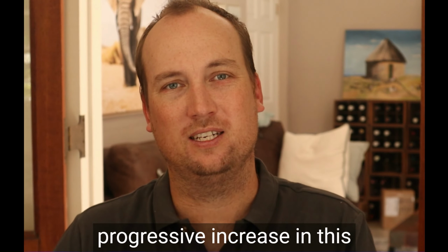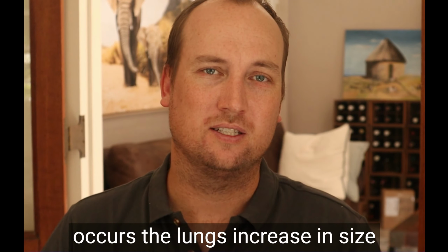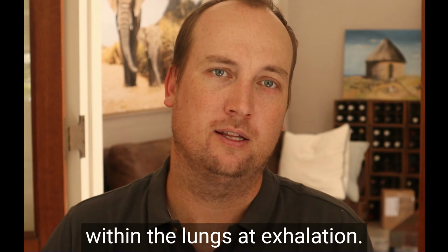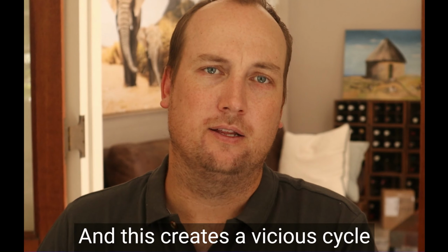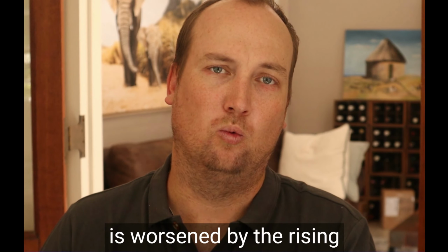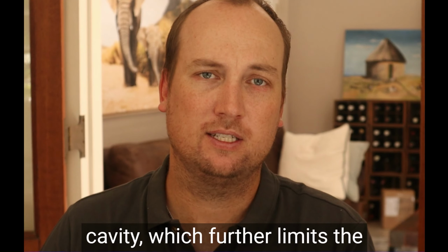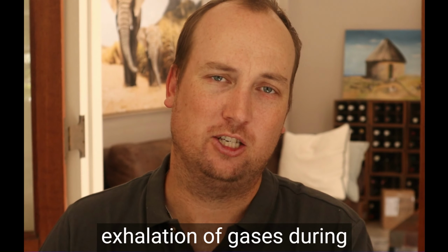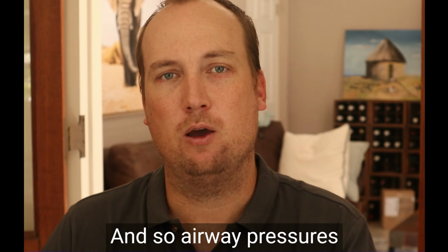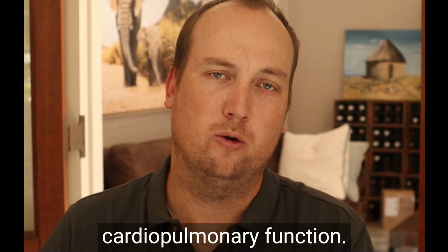And so this results in a progressive increase in this baseline lung volume, and as that occurs, the lungs increase in size, and so they increase in pressure, and we have a rising pressure within the lungs at exhalation. And this creates a vicious cycle where each further breath is worsened by the rising pressure within the intrathoracic cavity, which further limits the exhalation of gases during the passive exhalation phase. And so airway pressures continue to rise, and this can have significant effects on cardiopulmonary function.